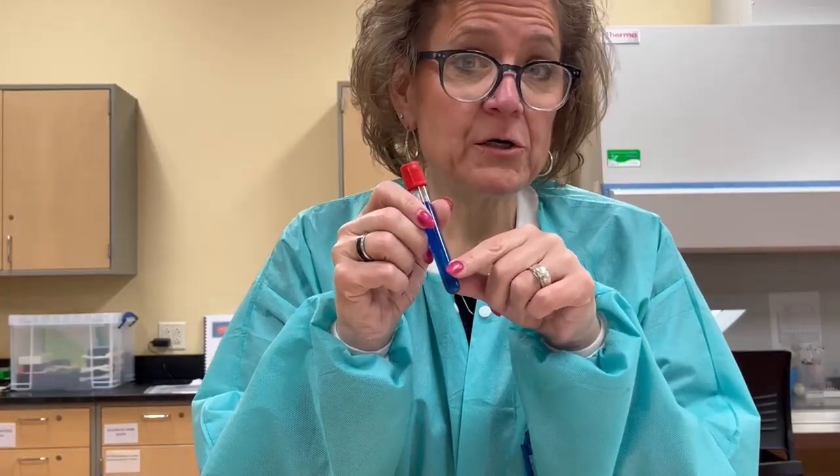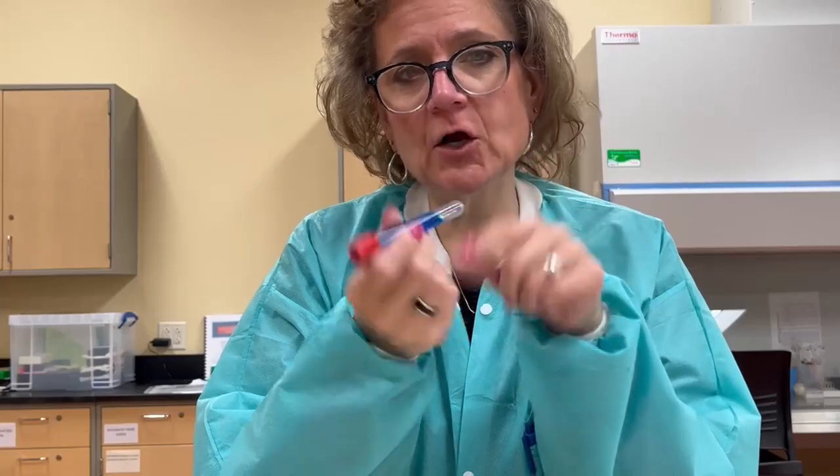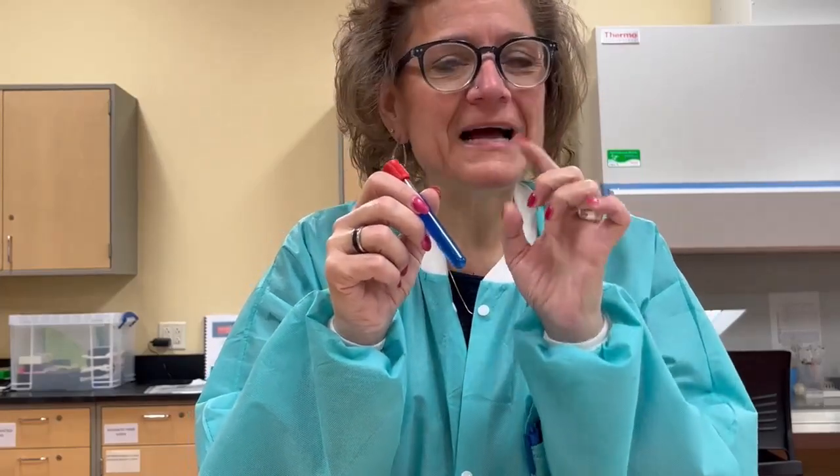Note also, this is water. Water is going to go a lot faster than blood. Blood is more viscous, so it will take even a little bit longer to get that full inversion in.